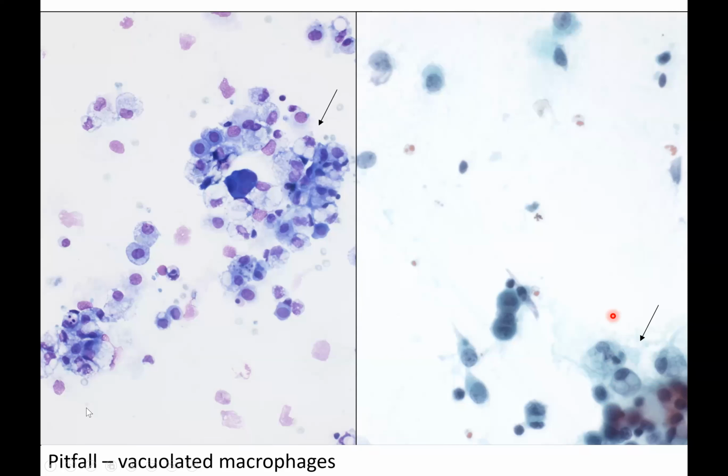It is fair to say that both with vacuolated mesothelial cells and macrophages, most of us have probably resorted to immunocytochemistry at one point just for our reassurance. The international system describes all these changes in reactive mesothelial cells under its negative for malignancy chapter.